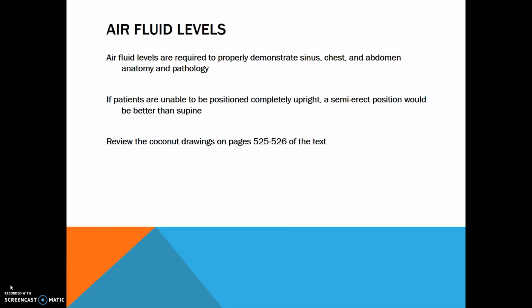Air fluid levels are required to properly demonstrate sinus, chest, and abdomen anatomy and pathology. If patients are unable to be positioned completely upright, a semi-erect position would be better than supine. Review the drawings in the text for examples of this.